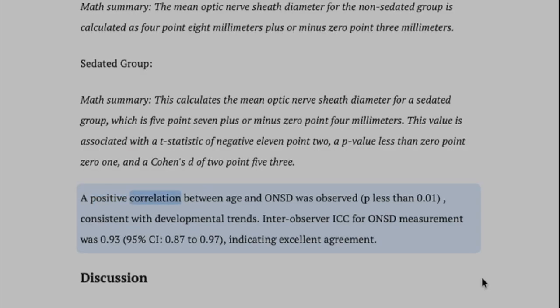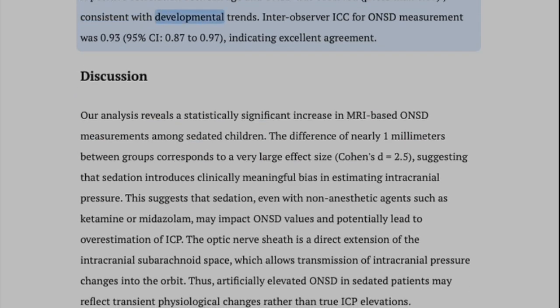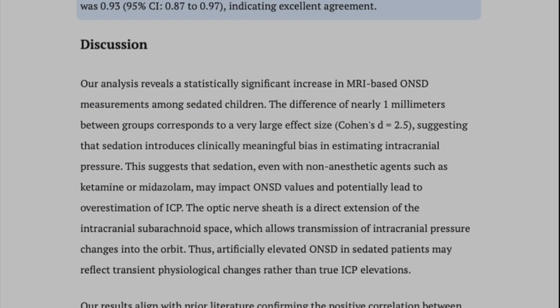A positive correlation between age and ONSD was observed, p less than 0.01, consistent with developmental trends. Inter-observer ICC for ONSD measurement was 0.93, 95% CI, 0.87 to 0.97, indicating excellent agreement.